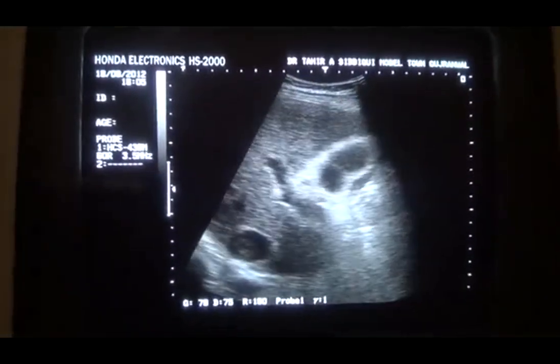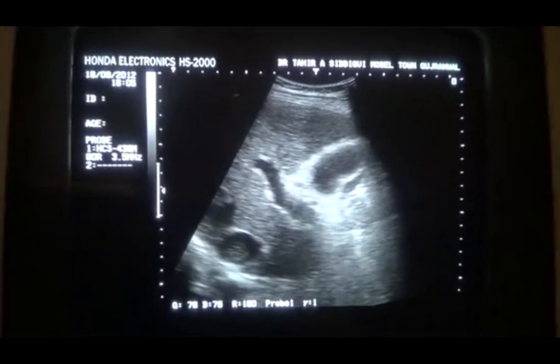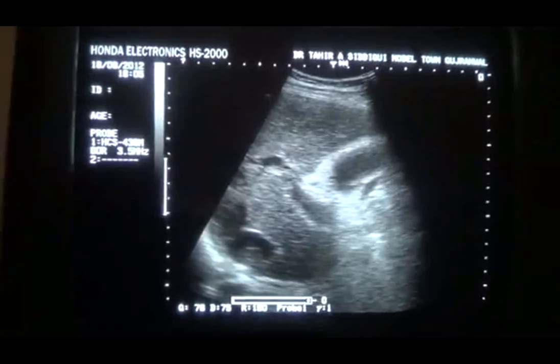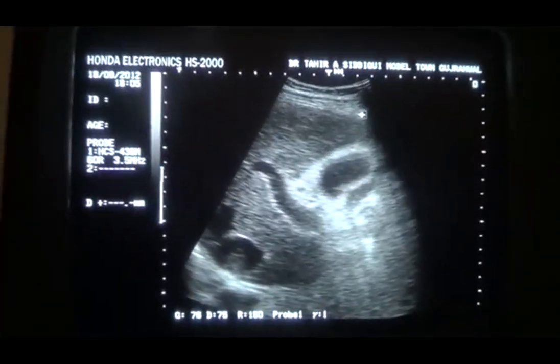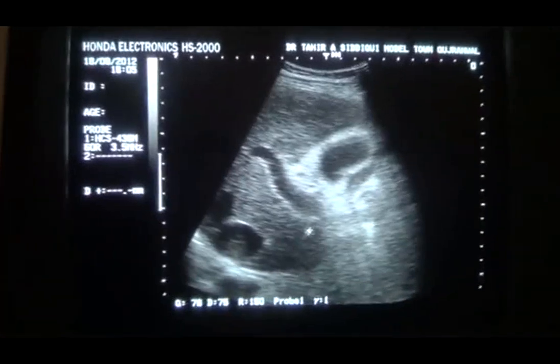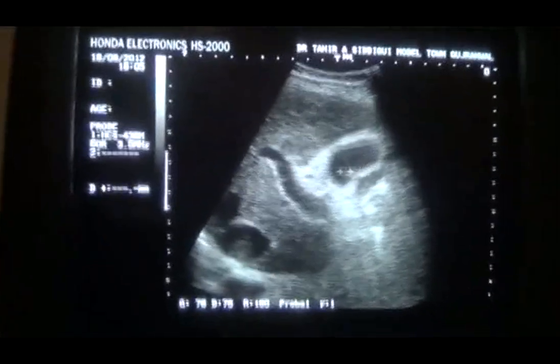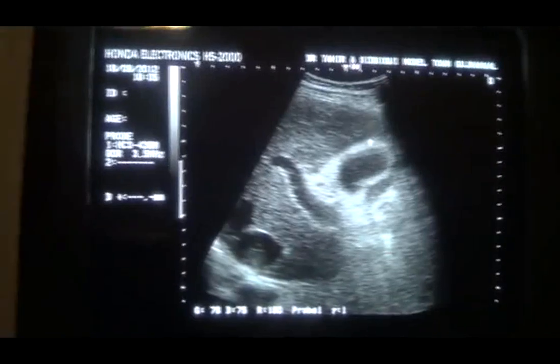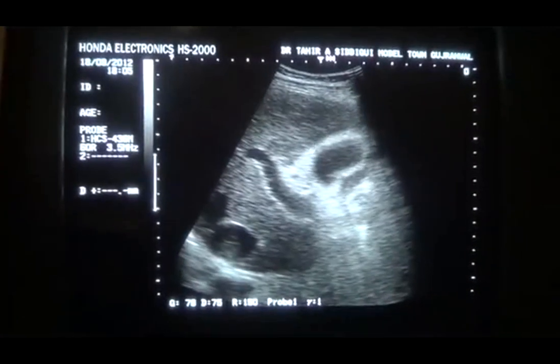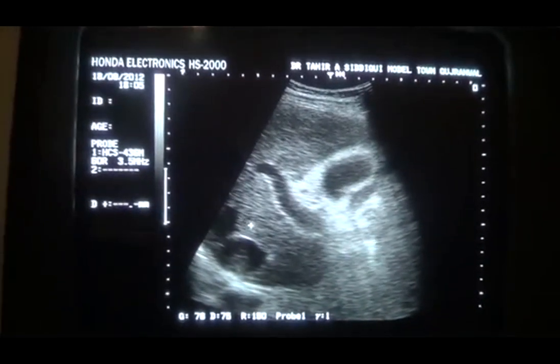Here I am showing you an image of a cirrhotic liver. This is the outer surface, this is the raised echogenicity of the liver, and the coarse texture is also in front of you. This is the portal vein, this is the gallbladder, and the walls of the gallbladder always appear thick in cirrhotic liver in most of the cases. This thickness of the wall is because of the adjacent cirrhotic liver.